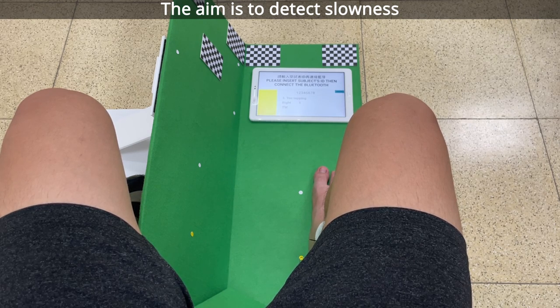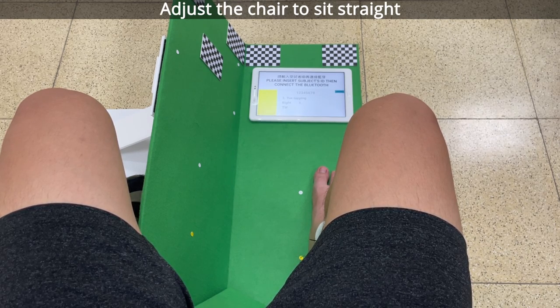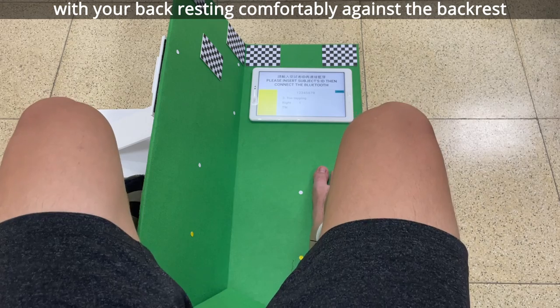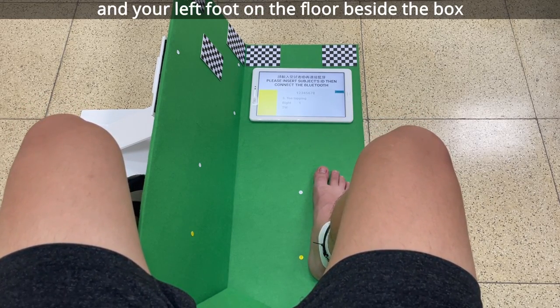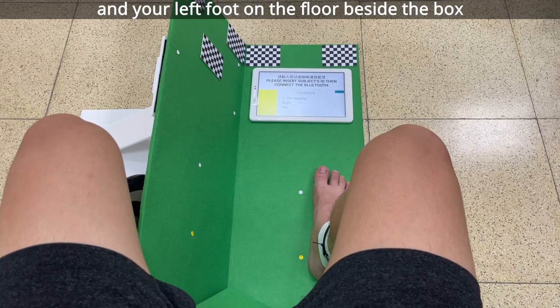The aim is to detect slowness. Adjust the chair to sit straight with your back resting comfortably against the backrest and your right foot in the box and your left foot on the floor beside the box.